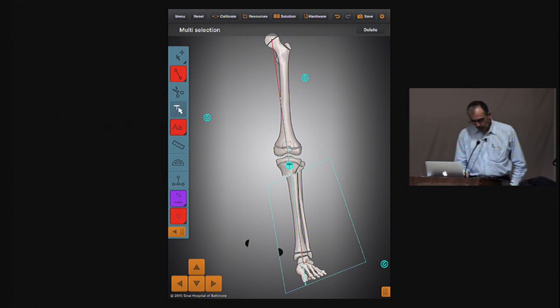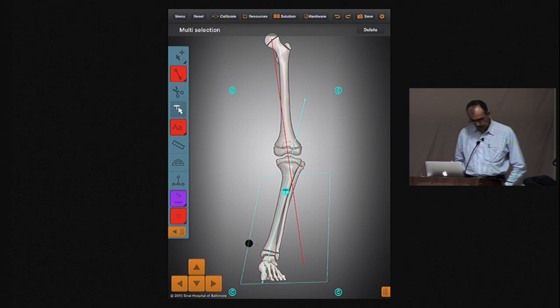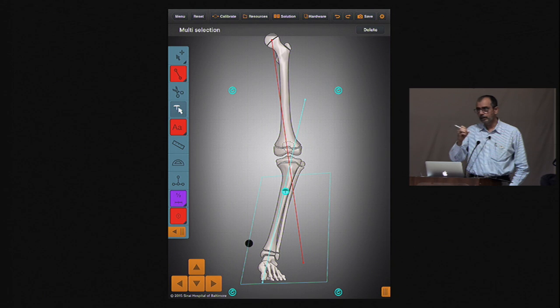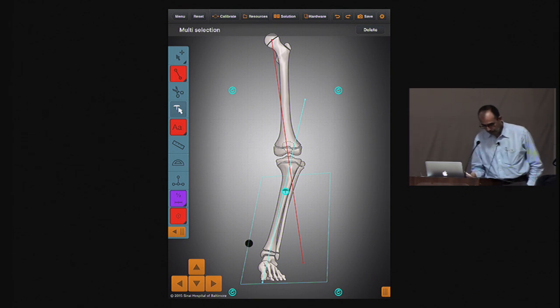But let us say you are not comfortable with the use of the Ilizarov, and you say, I am going to use internal fixation. But now I know that these osteotomy rules are there and my osteotomy should be at the level of the CORA, but I do not want to take any chance with the epiphysis. So, you will do the planning, and with the planning you will plan for, let us say, a closing wedge with the hinge at the level of that pin over there.